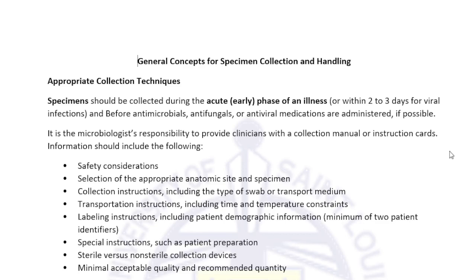Pag after na yung acute or early phase of illness, or after administering antibiotics, the population of the bacteria is lowered or is already low, there's a chance that we may not be able to grow them in the laboratory, that may lead to false diagnosis. Okay?